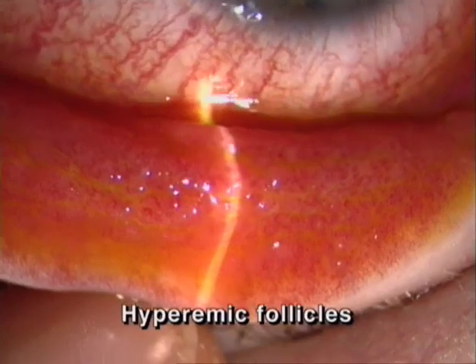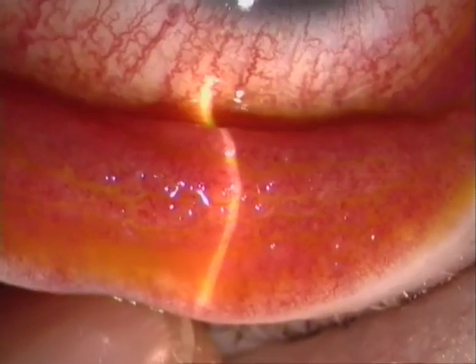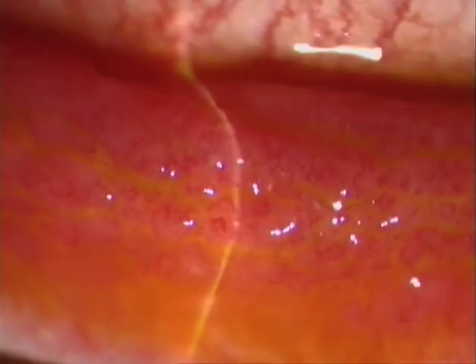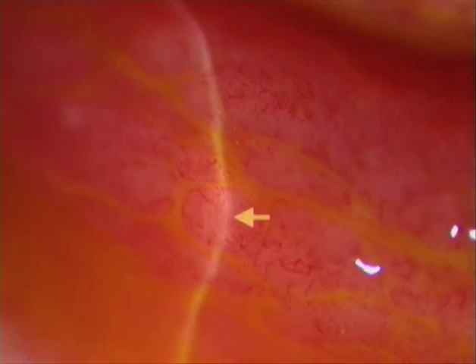Hyperemic follicles. In this case, hyperemia hides details in the conjunctiva, but the reflexes indicate multiple globular elevations. Based on the position in the orbital conjunctiva, one may suspect follicles, but based merely on their aspect, it is difficult to determine whether the protrusions are follicles or papillae. Because in a hyperemic conjunctiva, one can barely attribute the visible vessels to a central core or a peripheral corona. However, in indirect lateral illumination, one can find the bright central masses of follicles and so establish the diagnosis.